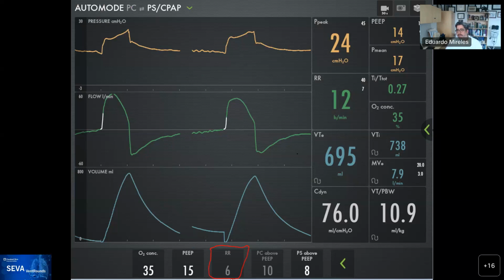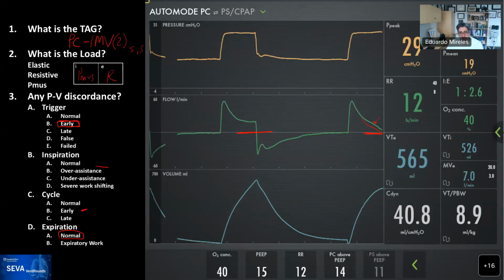to come in and to do what it should. So even though the rate was relatively low down here, you can see that the patient was breathing at the same rate that was set on the machine. And so it took a further decrease on the respiratory rate to observe that. Now, sometimes that doesn't help and solve it, and then you have to just tolerate while the patient comes out of the sedation effect, which can take hours and it can take days in general.